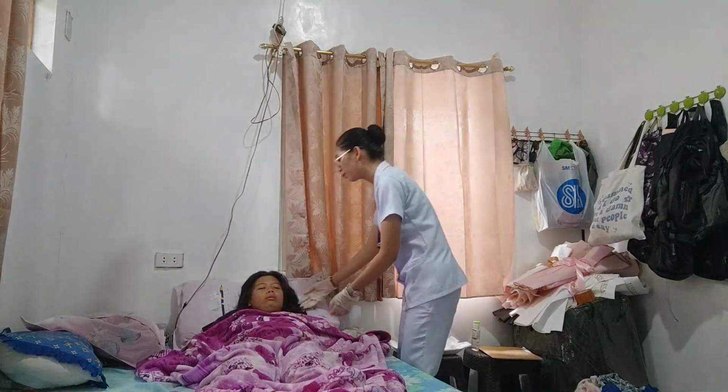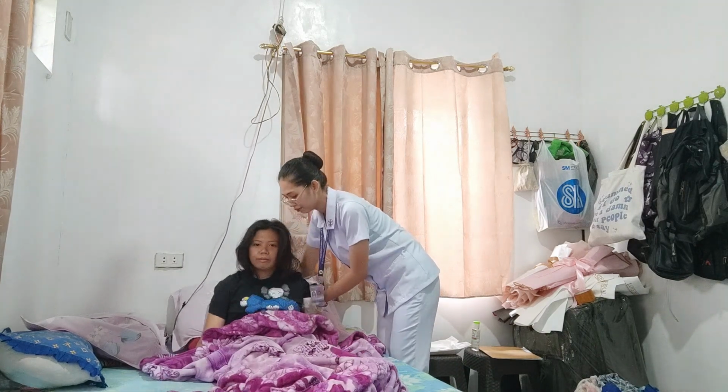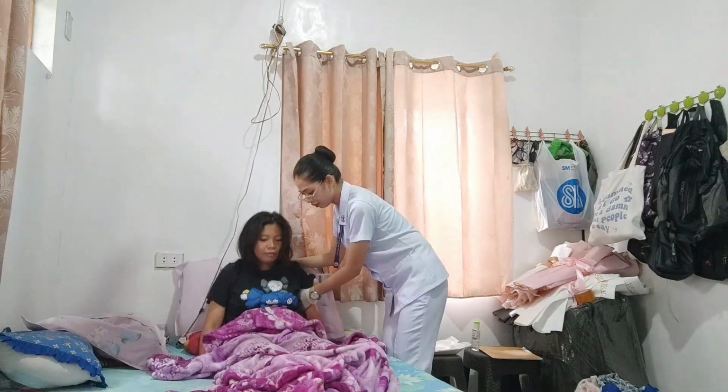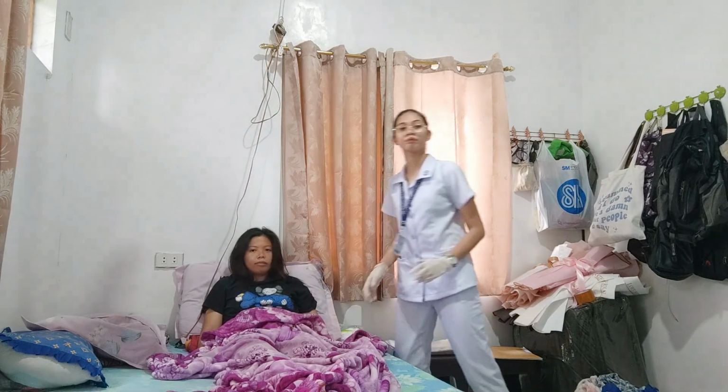After that, we're going to assist the client to a supine, lateral, prone, or sitting position depending on the chosen site. So since the chosen site is the deltoid muscle, therefore I will assist the client into a sitting position. Okay, ma'am, I'm going to put you in a sitting position. Can you help me carry yourself? Yes. Okay. For a while, ma'am. Okay, are you comfortable in that position? Yes.